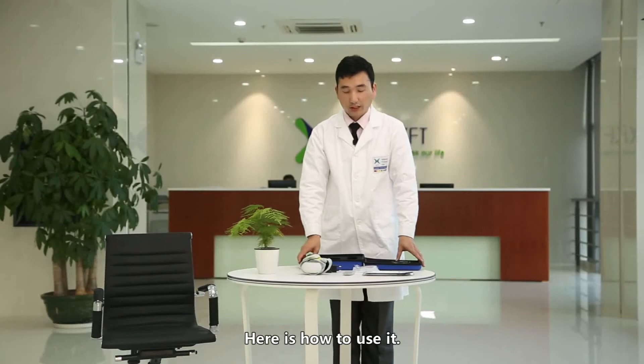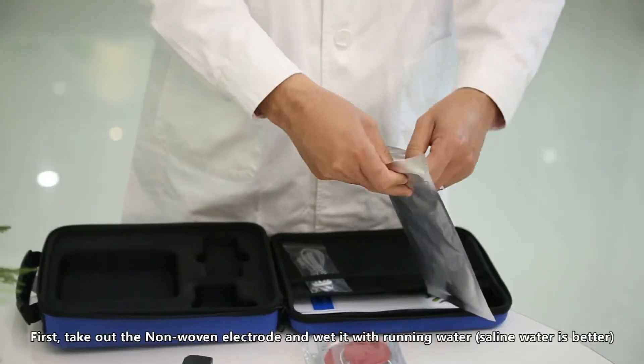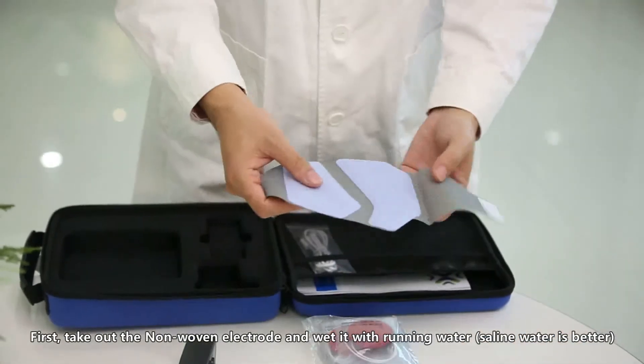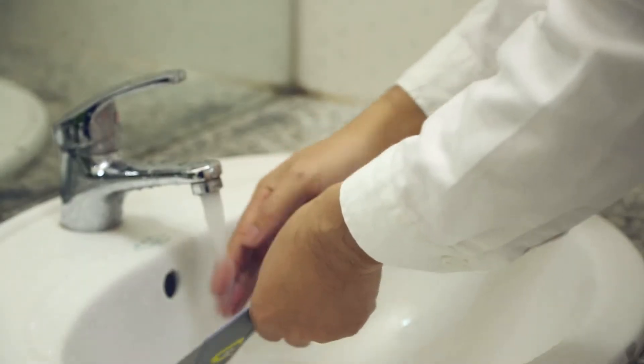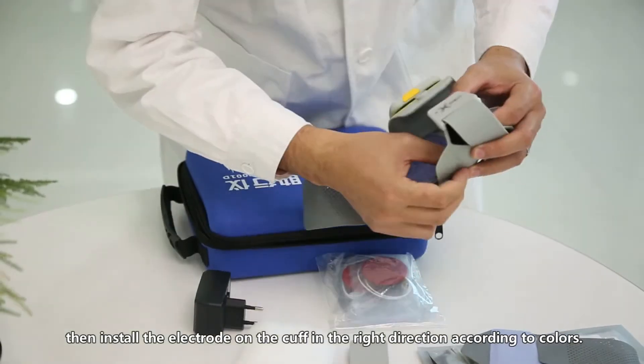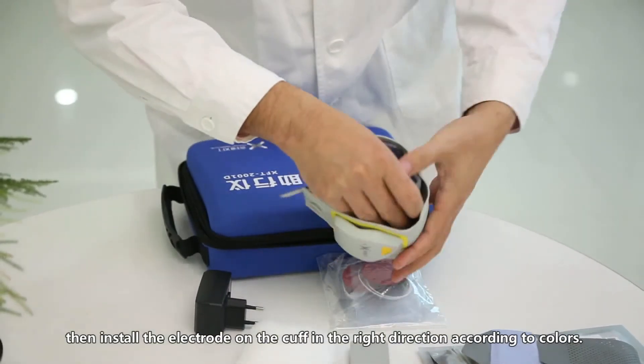Here is how to use it. First, take out the non-woven electrode and wet it with running water — saline water is better. Wipe out extra water, then install the electrode on the cuff in the right direction according to colors.